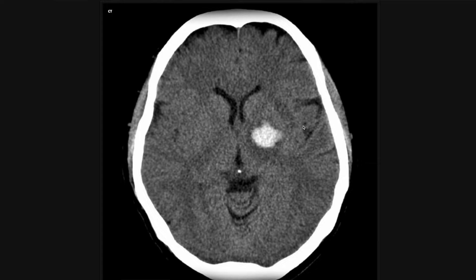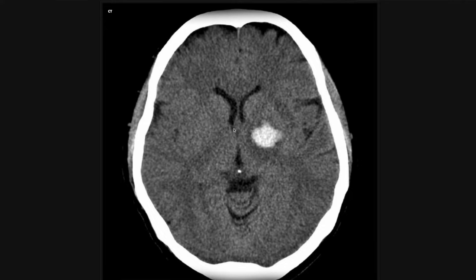This next case is just a single image, and it reflects a hemorrhage within the basal ganglia on the left. Hemorrhage is bright on CT — so anything bright, think hemorrhage. This is a relatively small hemorrhage within the putamen on the left. There is a little bit of mass effect: notice the frontal horn of the right lateral ventricle is bigger than the one on the left, displaced by the hemorrhage. When you see a hemorrhage in this location — or involving the thalamus or any of the basal ganglia — think hypertension. Hypertension is the most common cause, and within the basal ganglia is relatively classic for a hypertensive hemorrhage.